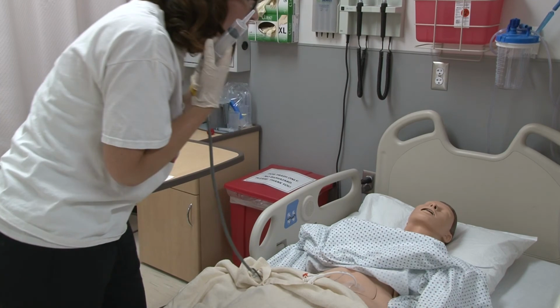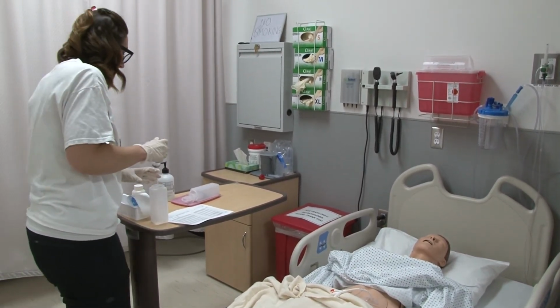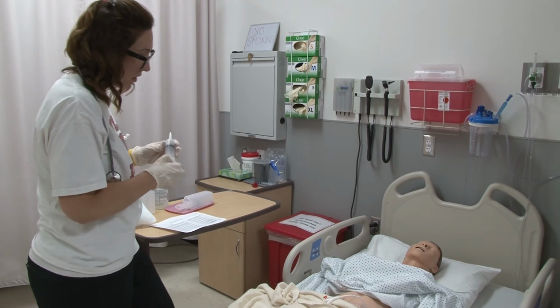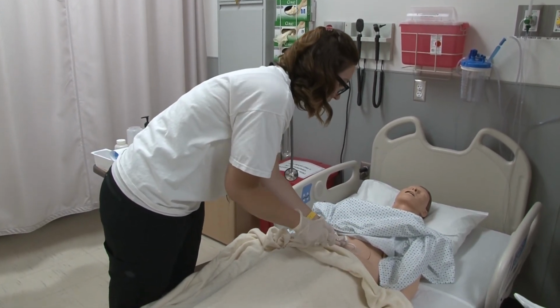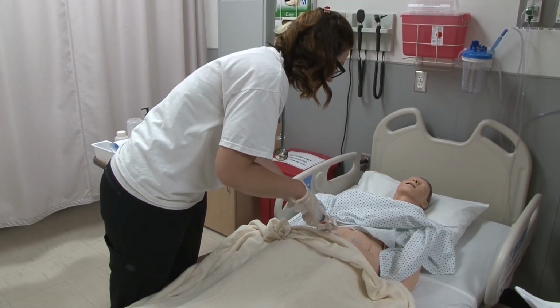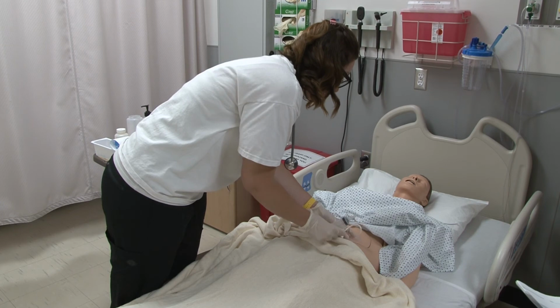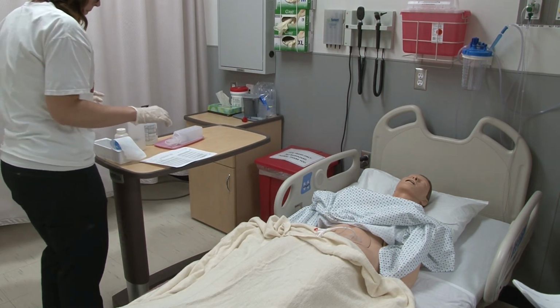Okay. And real quick, I'm going to go ahead and draw up some water here at the bedside to check for patency. And again, approximately 20 mLs of water, just to make sure it's flushing well. Okay. And it's flushing well, no issues. I'm going to clamp the tube a little bit and close it off. Okay, Mr. Rogers, everything looks great here with your Gtube, so now I can go ahead and administer your medications.